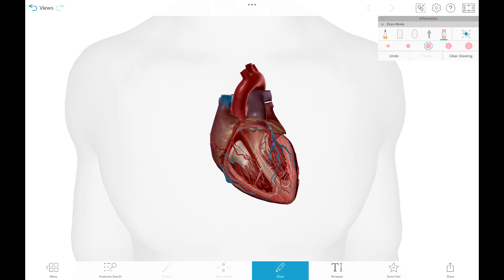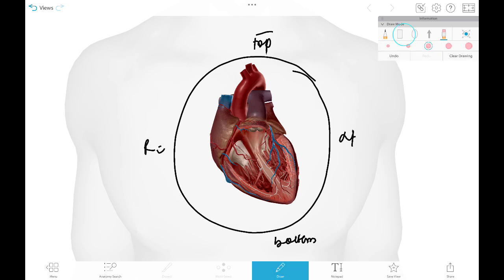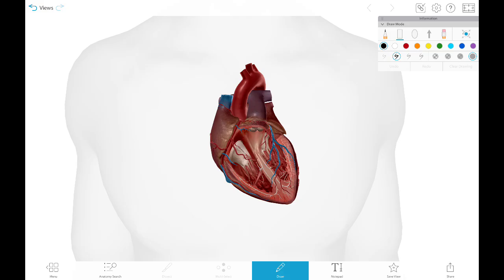One plane is the vertical plane. It will cover the top side of the heart, and the bottom side of the heart, and also the left and the right side of the heart. But for the other aspects, we have to see that there is also the other part of the heart which is lying in this direction. This plane is called the horizontal plane.